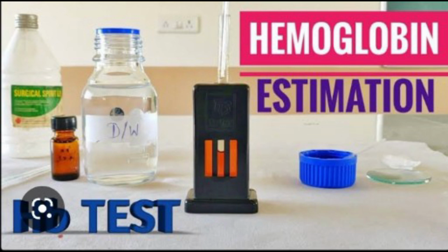Procedure: copper sulfate solution of specific gravity 1.055 for male and 1.053 for female is taken in two test tubes. The specific gravity corresponds to the minimum Hb level for the respective sexes. 1.055 specific gravity corresponds to 13 grams per deciliter. Specific gravity 1.053 corresponds to 12 grams per deciliter of hemoglobin.